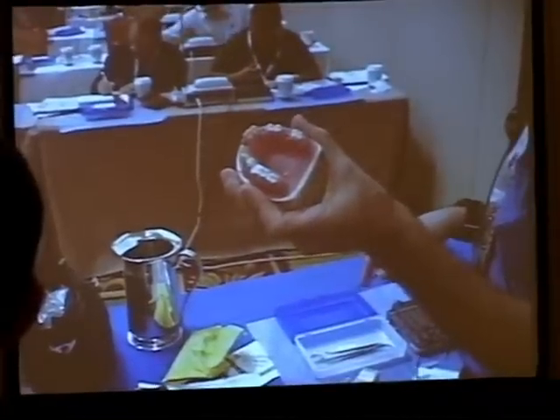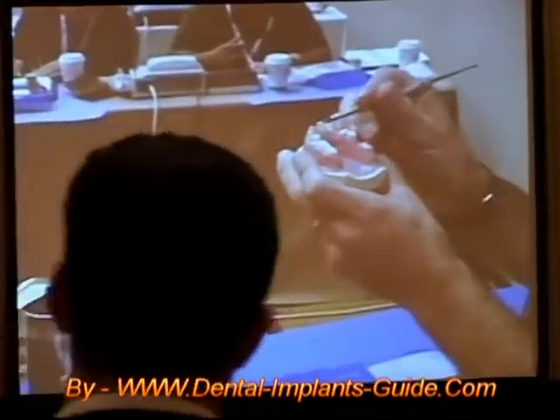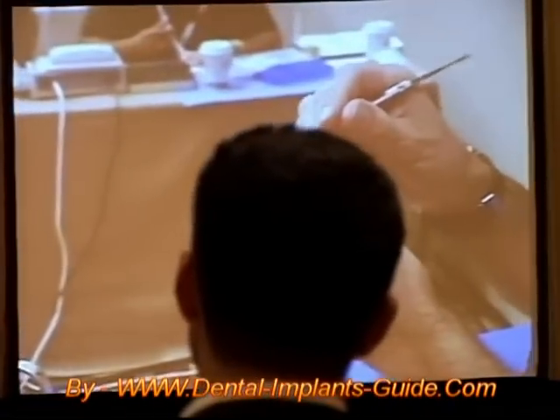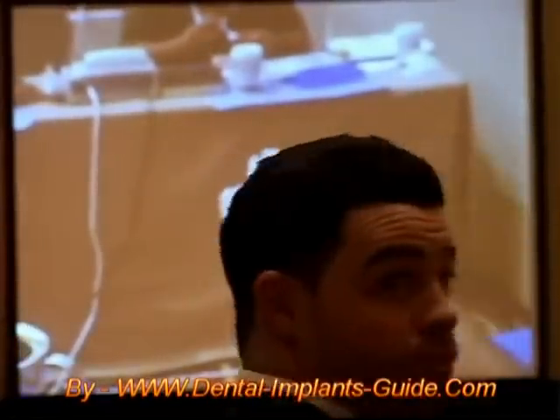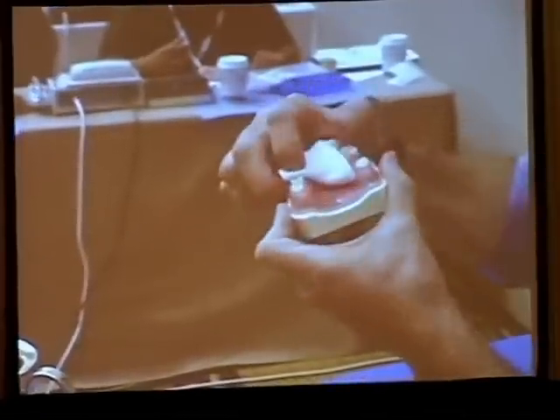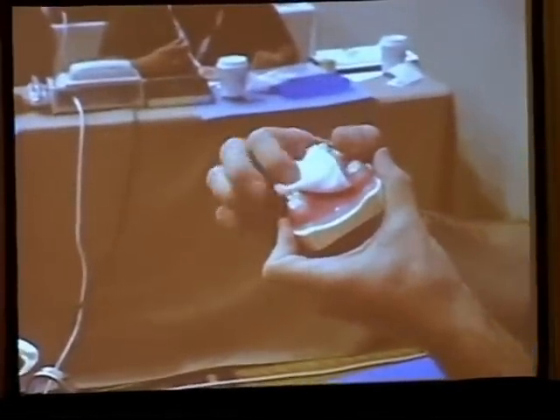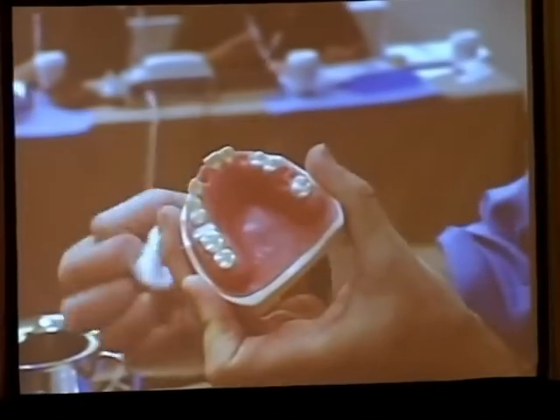And in the mouth, that's how long it takes. You have — and you can feel it with the back of your instrument — probably another 30 to 45 seconds working time. If the material is wet and it doesn't seem to be setting right away, just take gauze and place it over it. There it is.